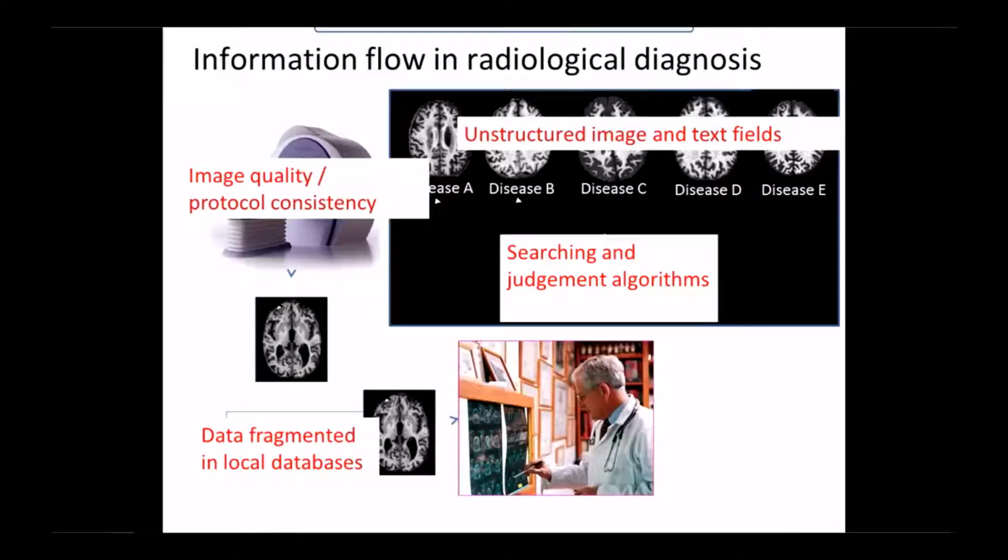Once the image data is put there, we really can never recall it after it's been looked at by the doctor. It's warehoused in an off-campus site. Johns Hopkins really doesn't re-look at the images, but of course you can currently do searches on the clinical variables that have been entered by the radiologist. And so one of the major technologies that we've introduced is the ability to search on image.